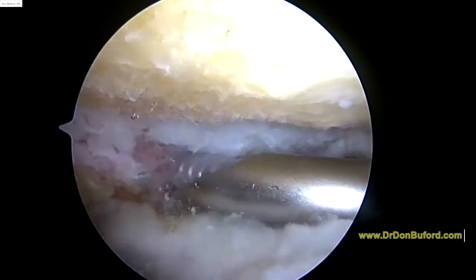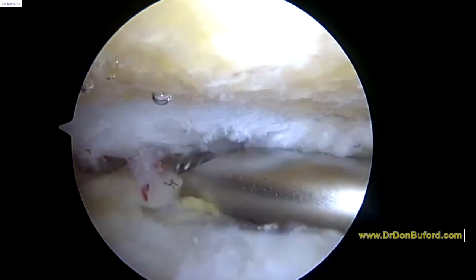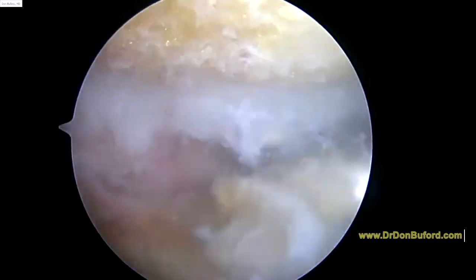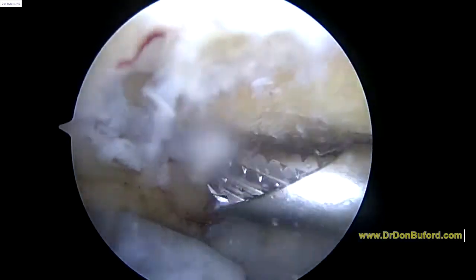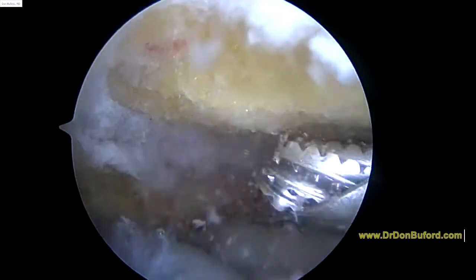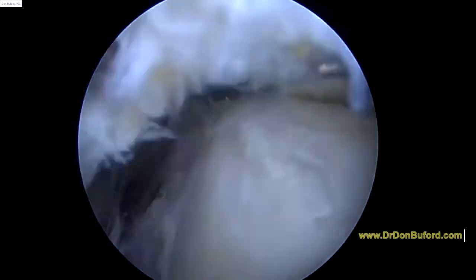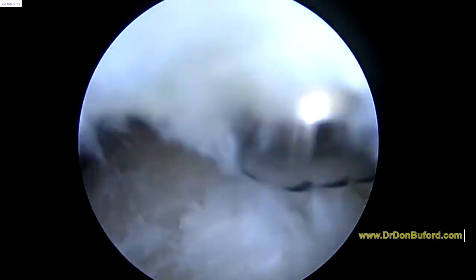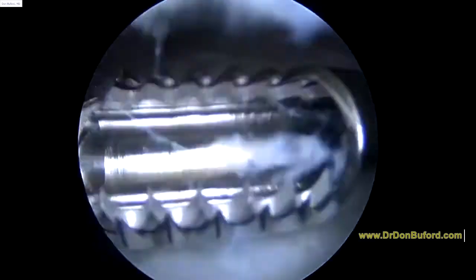Here's the cortical bone hanging down — you can make sure there's no spurs underneath it. Next we're going to have a look at the rotator cuff. Now we're looking down at the rotator cuff, and I'm just going to make sure that there's nothing abnormal here. There's a little bit of fraying where that bone spur was rubbing on it, but now that that spur is gone, that should be fine.